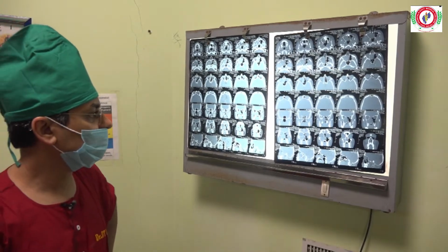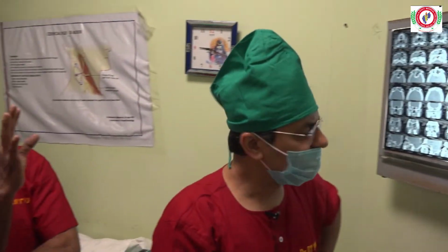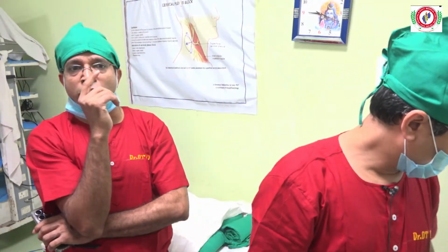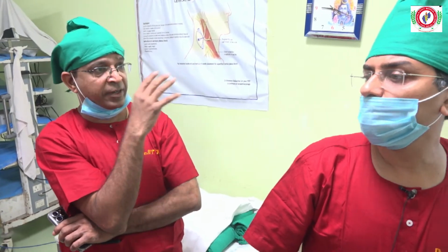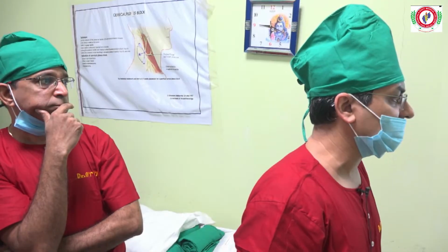If needed, I'll just remove this bone. I'll remove the inferior turbinate, I'll remove this part of the bone, and the whole of the maxillary sinus will be in front of me. Denker's would be ideal for this, because by doing Denker's you will reach the nooks and corners. Yes, we'll do Denker's. That is not a big issue. The second thing, the follow-up is easy.